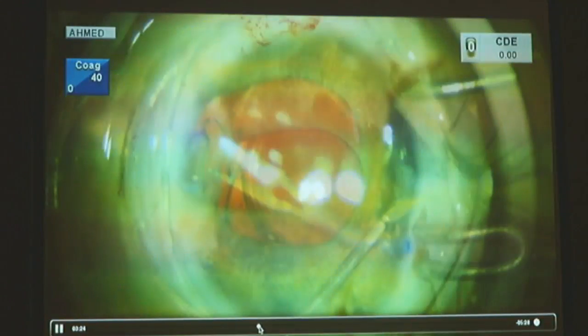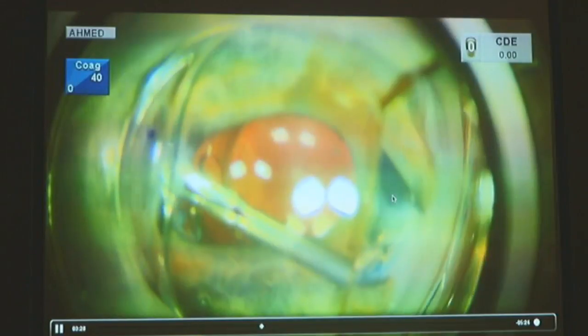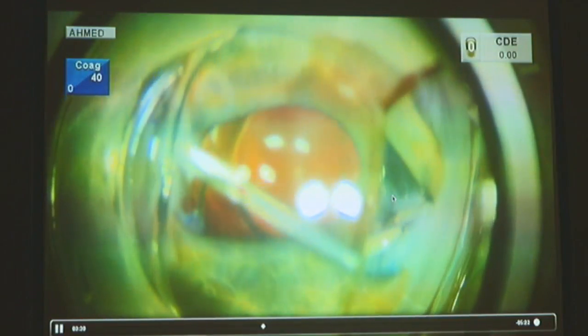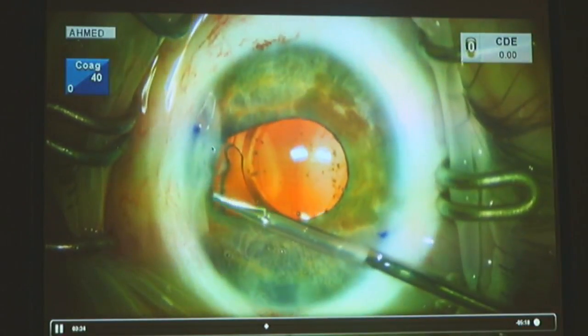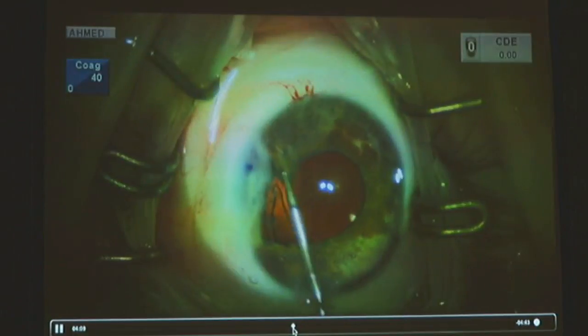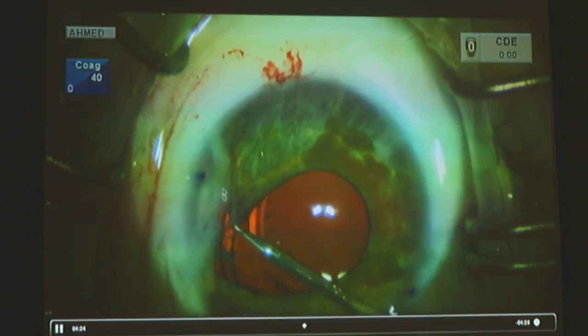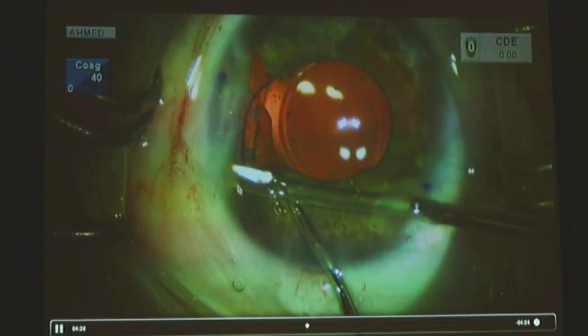And now, watch, what am I doing here? I'm cutting part of the capsular bag with the gonio lens because I want to release the traction up. And the lens is in the bag now, so I feel safe to do this. I also need to, of course, suture the iris inferiorly here. And we will cut the iris here to bring the 2 leaflets forward. Look, see, I'm cutting the attachment, the synechia here.